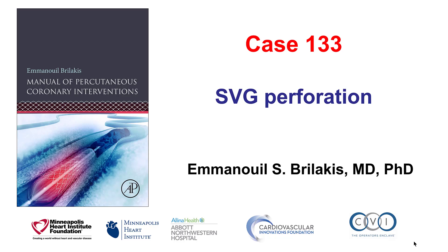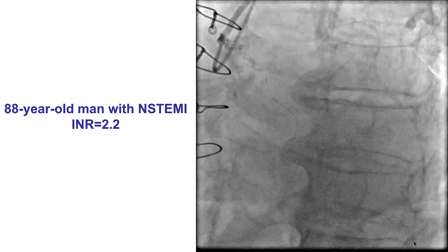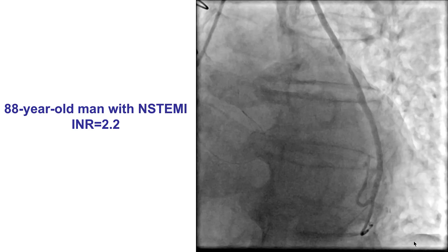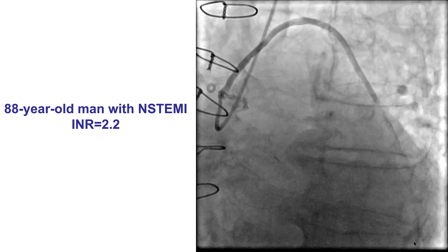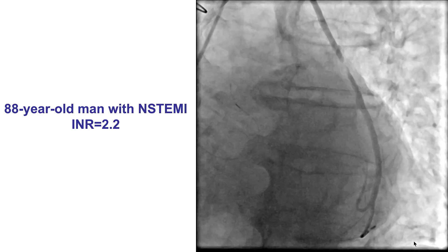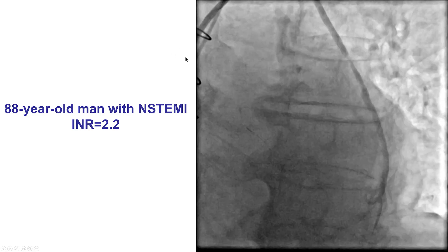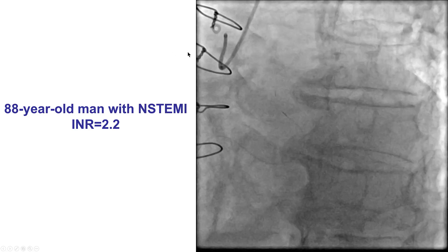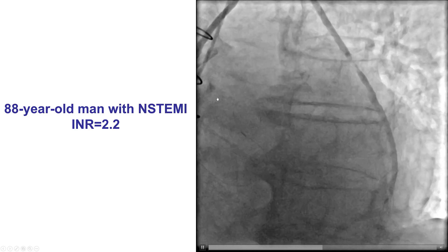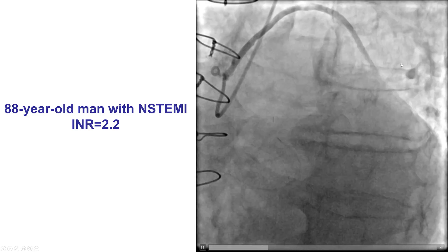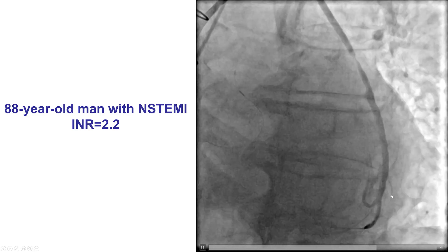Hi, this is Manos Brilakis, and this is case 133 for the Manual of Percutaneous Coronary Interventions. This is a case of saphenous vein graft perforation. The patient was an elderly gentleman that presented with non-ST elevation myocardial infarction. He was on warfarin with an INR of 2.2, so radial access was obtained to perform urgent coronary angiography. Using an AL-1 catheter — the preferred catheter for left-sided vein grafts — we found that the culprit lesion was in the saphenous vein graft to the obtuse marginal branch.